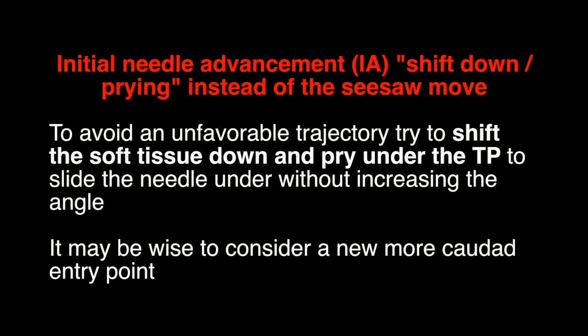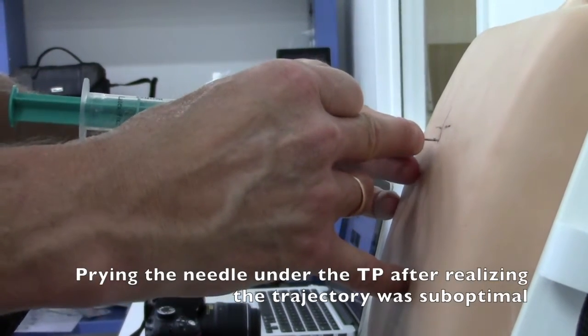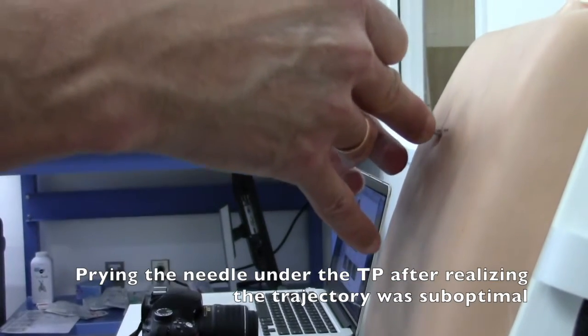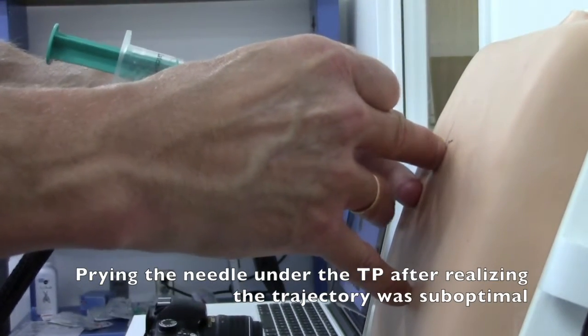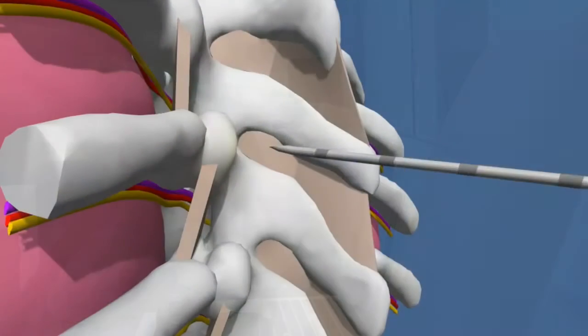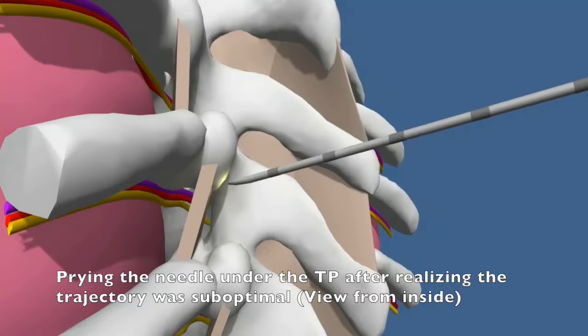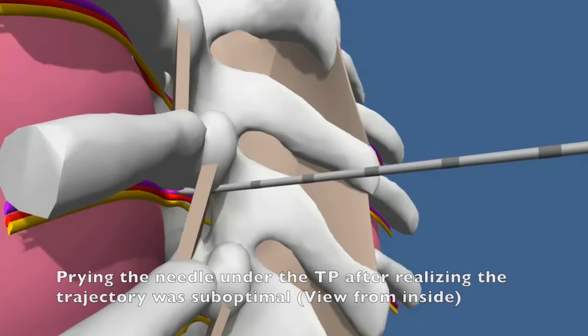To avoid an unfavorable trajectory, try to shift the soft tissue down and pry under the teepee to slide the needle under without increasing the angle. It may be wise to consider a new entry point. Here is what it looks like to pry the needle under the teepee after you realize the trajectory was suboptimal — including an inside view of the same maneuver.